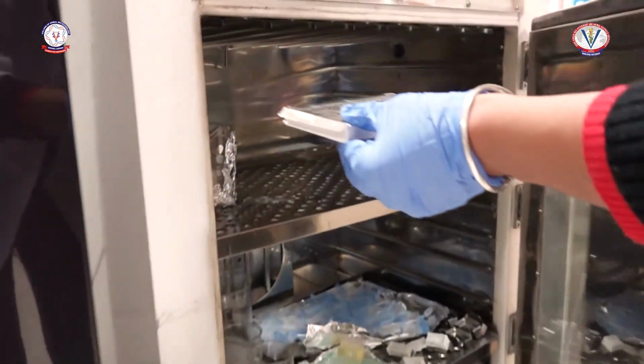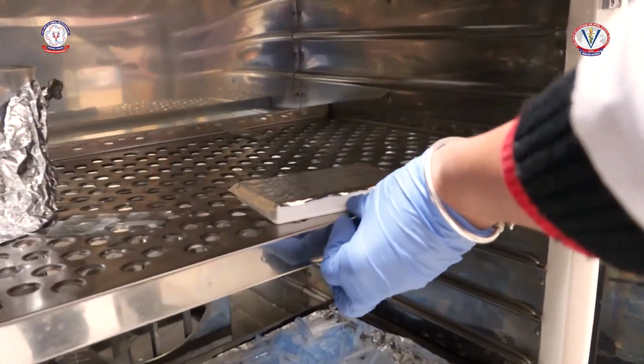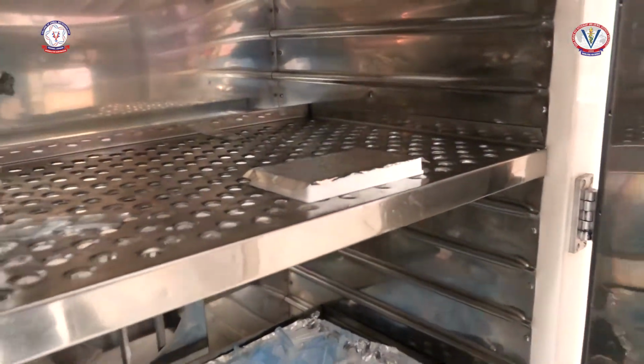Then the sample is incubated overnight at the temperature of 37 degrees Celsius.